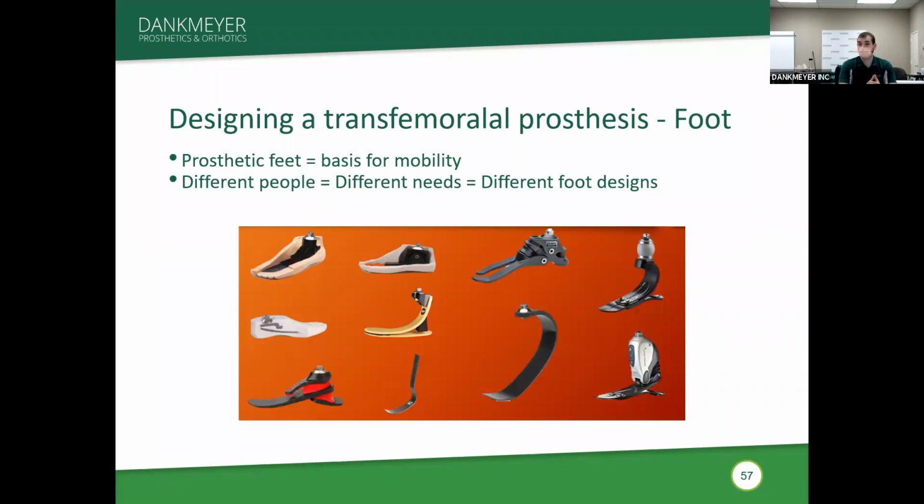Whereas if you have a really firm heel, that tends to induce a flexion moment at the knee, which then the patient would either have to voluntarily control with the residual limb, or the knee could buckle, depending on the design. So there are certainly more things to consider when choosing a foot, but at the end of the day, it does get back to that same basic concept of, what are the patient's goals for mobility? What do they need? Do they need something safe, secure, and stable, or do they need something more dynamic?